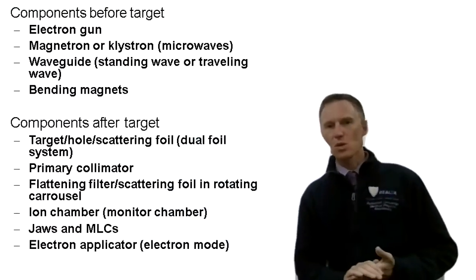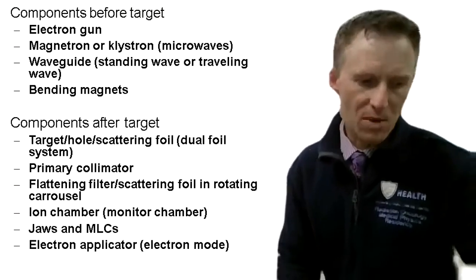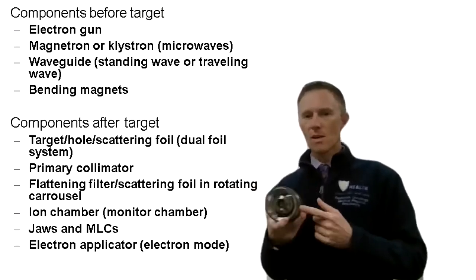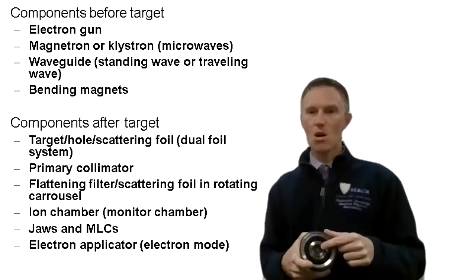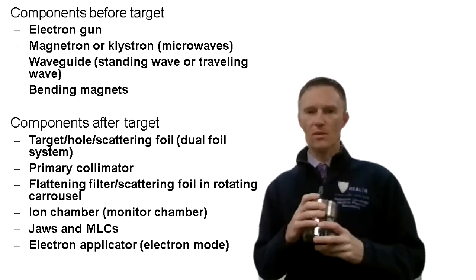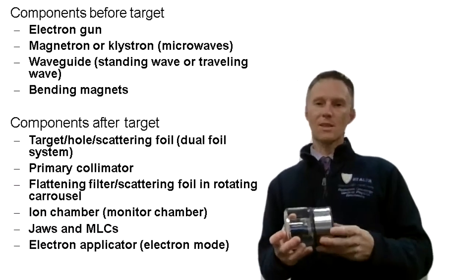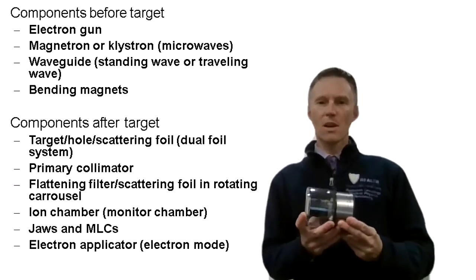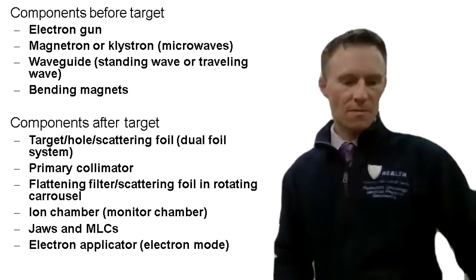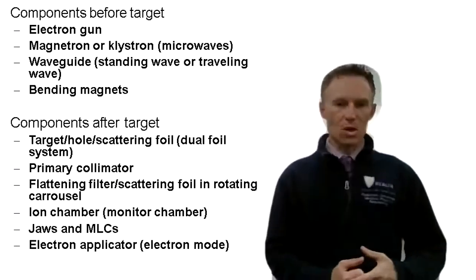The first component you would come across is the electron gun. I have an example of one here, but inside there is a filament — that filament gets hot and electrons are emitted from it. This is one example of an electron gun taken out of a linear accelerator. You've probably seen something similar to an x-ray tube, though this would be significantly larger to produce more power and current.